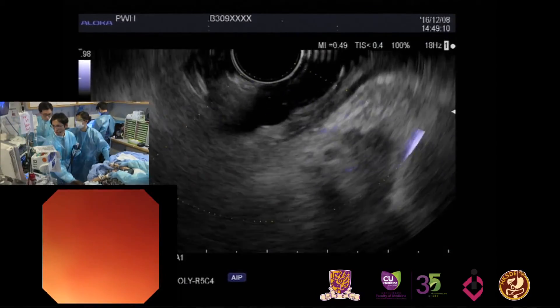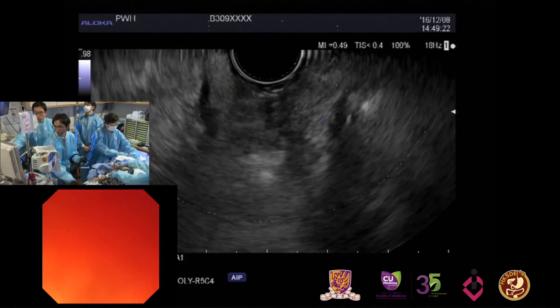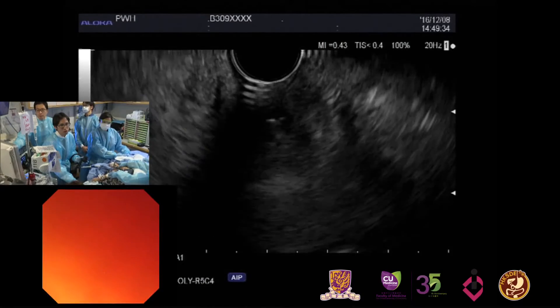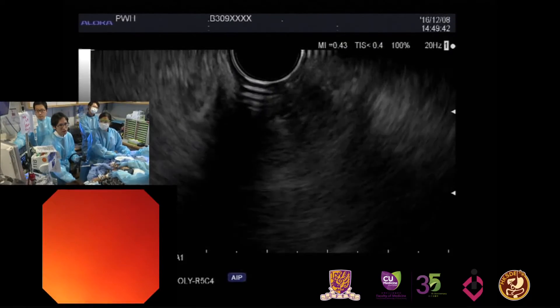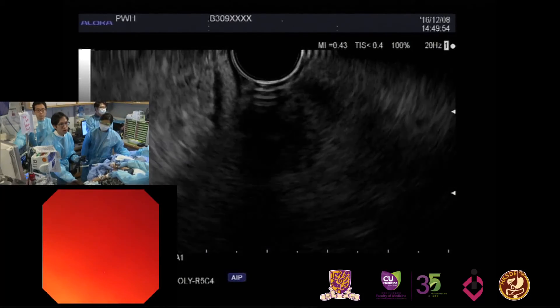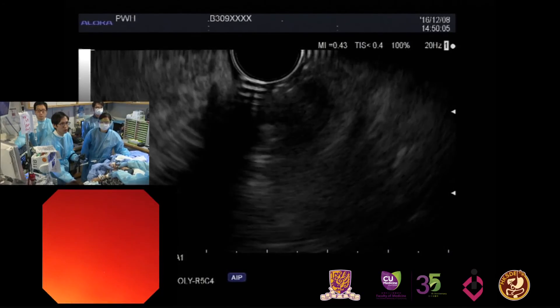The GVs are treated, but the esophageal varices are still visible, so I think they may not be GOV-1 type varices. For the GVs down here, I think we have obliterated them. Should we just leave the patient like this? The other option now is whether to glue the esophageal varices or just band them. My gut feeling is to choose banding for the esophageal varices, because we have no diagnosis of malignancy and the patient has no known chronic liver disease — we need more workup. For the GV bleeding, glue injection is justified, but it may be premature to do glue injection for the OV right now.